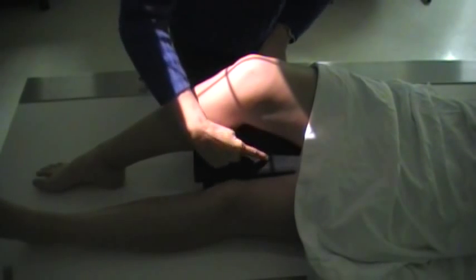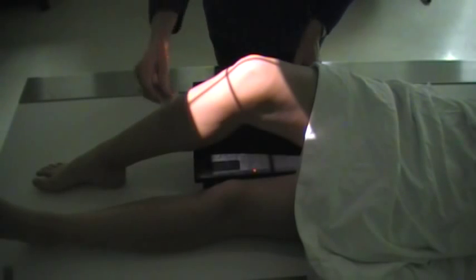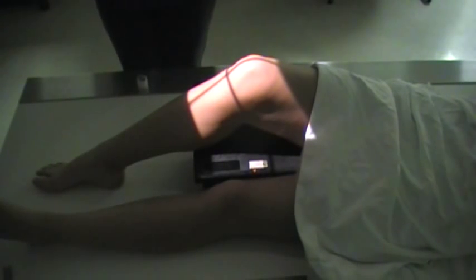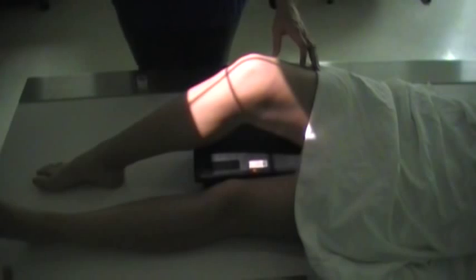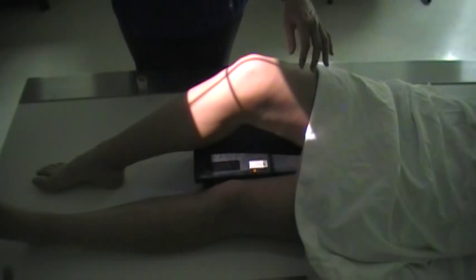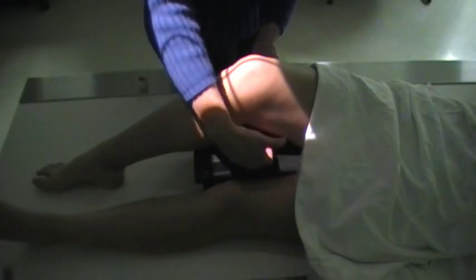Your central ray is going to enter a half inch below the apex of the patella. You want to double-check and make sure that your transverse line is being seen on the IR, because whenever you have to angle the tube, it is easy to angle it so that it's projected off — and we don't want to do that. I have approximately a 30-degree angle on my tube at this time. You want to check that the surface of the tibia-fibula is parallel with the face of the x-ray tube, and often this angle can vary from 30 to 40 degrees. You want to enter at this point and then the tunnel will be projected on the IR.